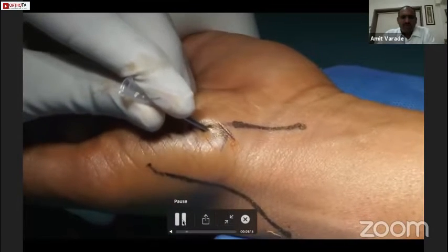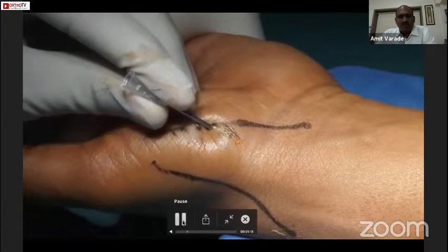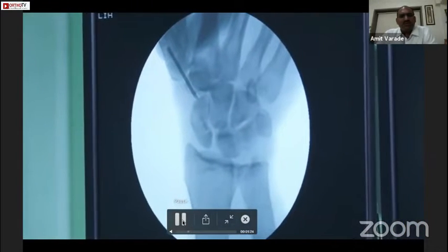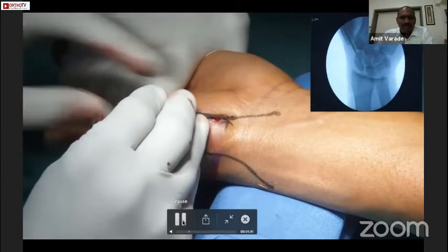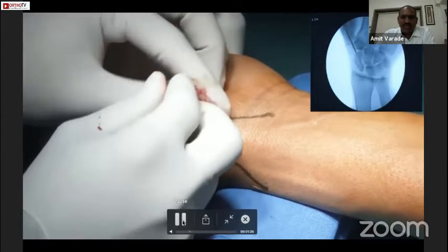Once we have done this, we use a 16-gauge needle for passing the guide wire — it acts as a sleeve. This is a very good device, and the good thing is we can see that needle under the C-arm as well. After putting the needle onto the distal pole of the scaphoid, you just check it in the C-arm.